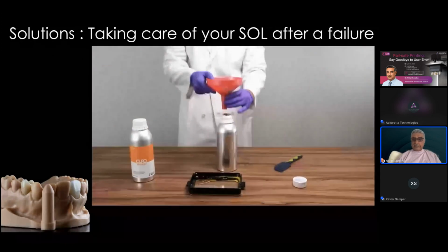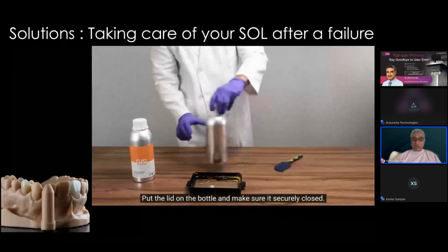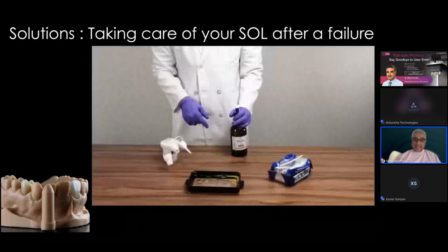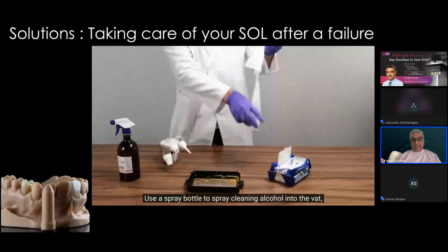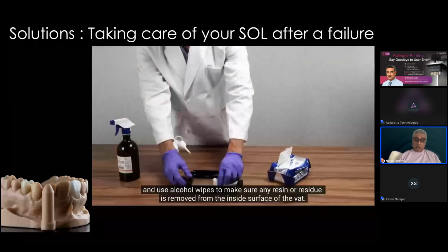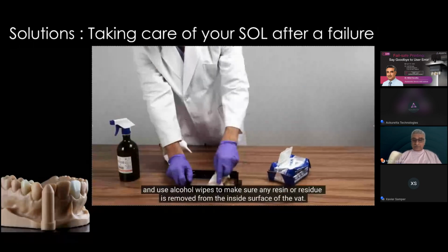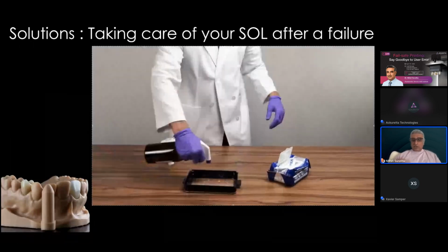obviously seal it, and then you can clean your vat to make sure that there is no particular debris. You can do that by spraying IPA into the vat and mopping up the excess alcohol using tissues. I'm sorry, wipes. And so do that repeatedly until there's absolutely nothing left in the vat and your film is absolutely clean.